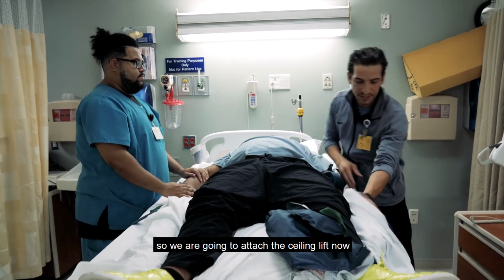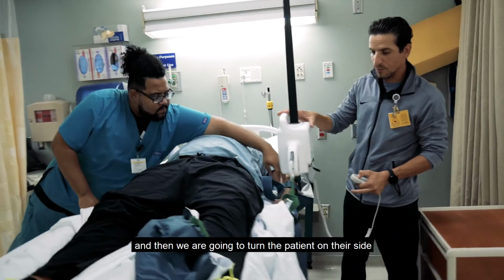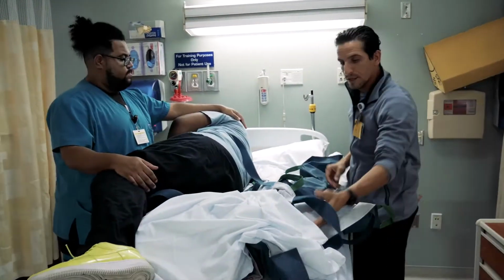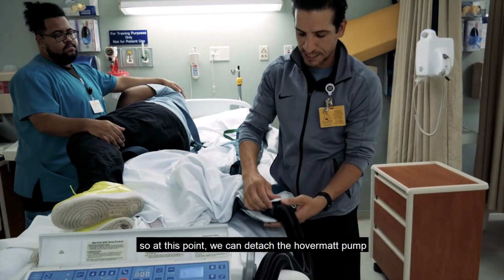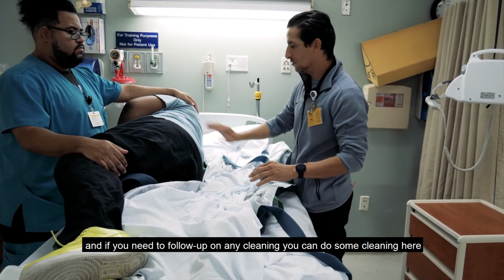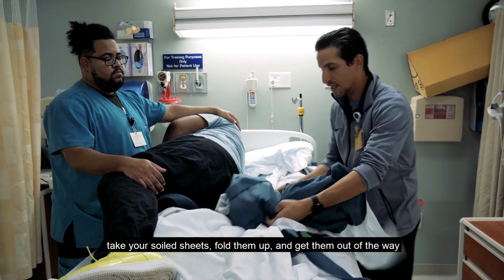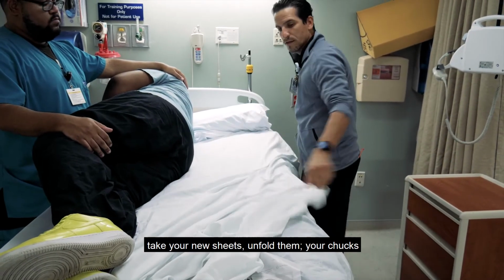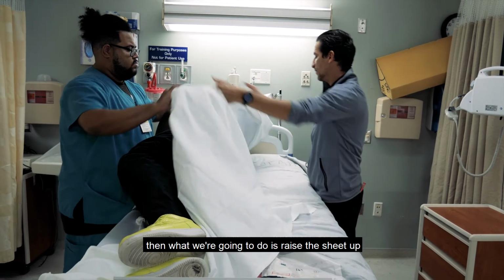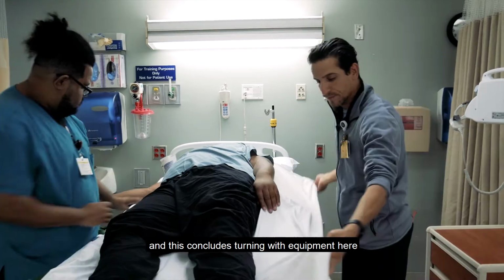So we are going to attach the ceiling lift now to the new hover mat. And then we are going to turn the patient on their side. So at this point, we can detach the hover mat pump. And if you need to follow up on any cleaning, you can do some cleaning here. Take your soiled sheets, fold them up and get them out of the way. Take your new sheets, unfold them, your chucks. Then what we're going to do is raise the sheet up and we are going to wedge the patient. And this concludes turning with equipment here.